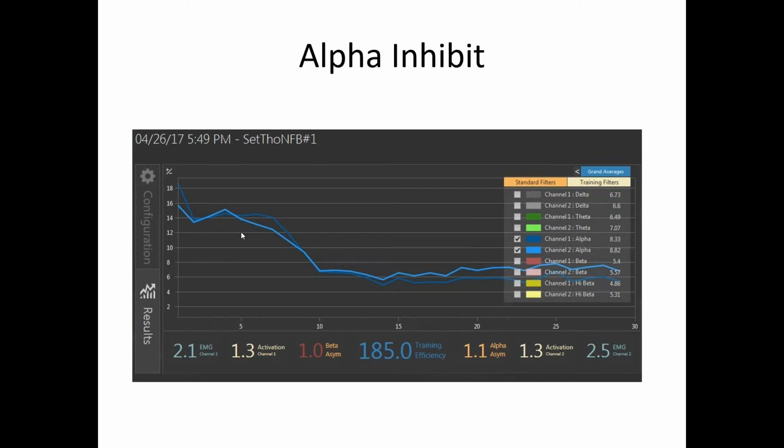So delta and theta may move around in amplitude in gross patterns because the electrical environment's becoming more hostile. But when you're seeing shifts in beta, that's from muscle harmonics. So all of it's artifact when they move. But in a sense, when you see that movement, you're seeing them show a state, they're physiologically readjusting their posture. And that's usually reflecting a change in mental state too.